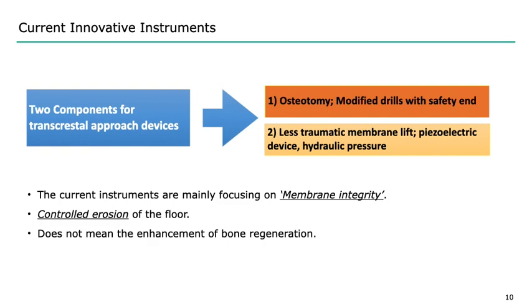So these modifications are mainly focusing on membrane integrity. So all that newly developed methods are focusing on protecting the soft tissue. The traditional principle of internal lift was green stick fracture of the floor, but the current concept now goes to the controlled erosion of the floor using new instruments.